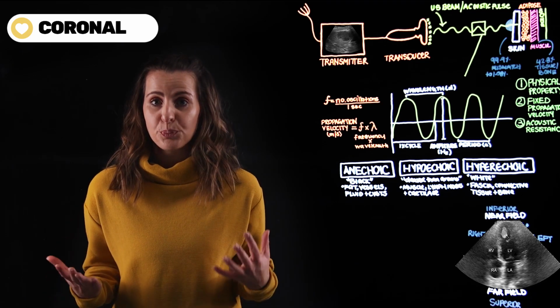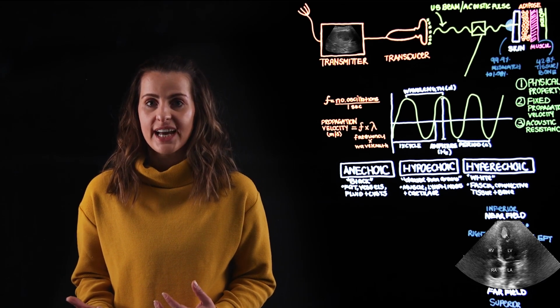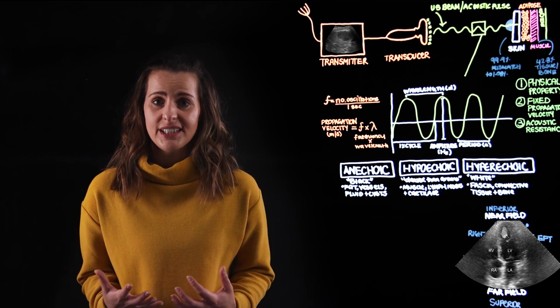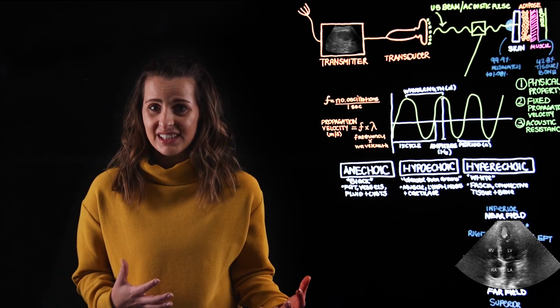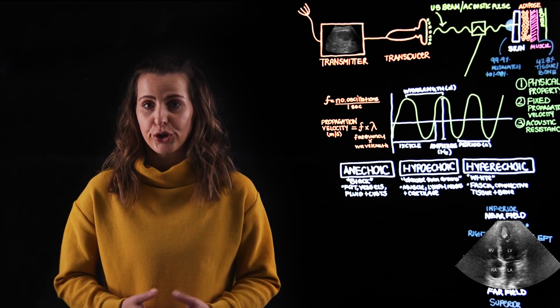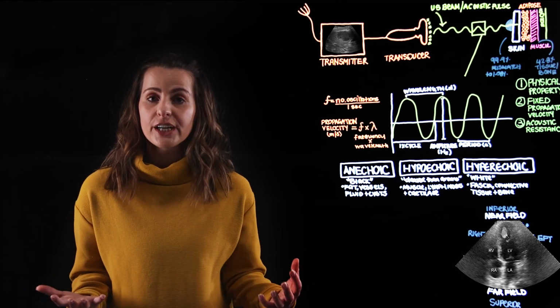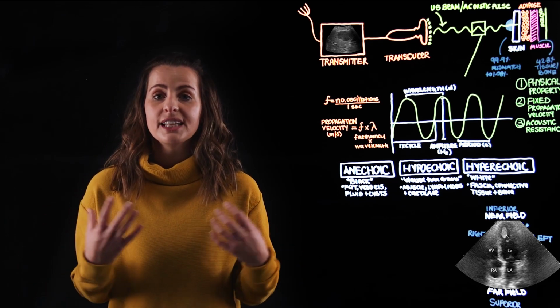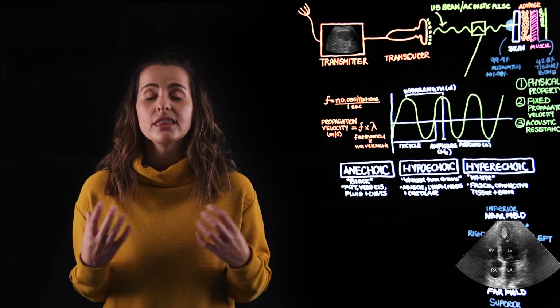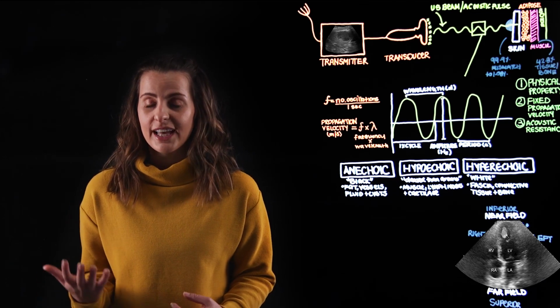I hope that this has broken down the concepts and principles associated with ultrasound in an easy manner. I haven't gone through a great deal of detail pertaining to medical physics, because this isn't really necessary at a year 2 level in the medical program. But I hope by going through the terminology, the interactions with common tissues, the attenuation and the orientation of the scan, that this makes it a little bit more manageable and less scary when you next stumble across an ultrasound image.